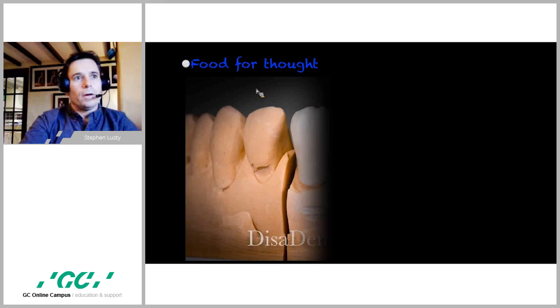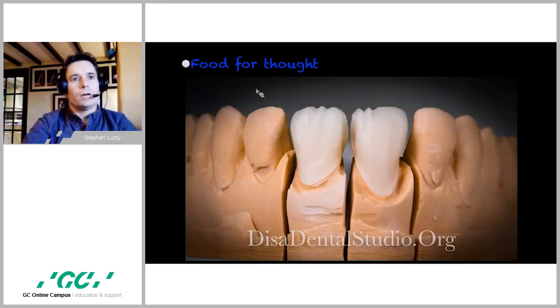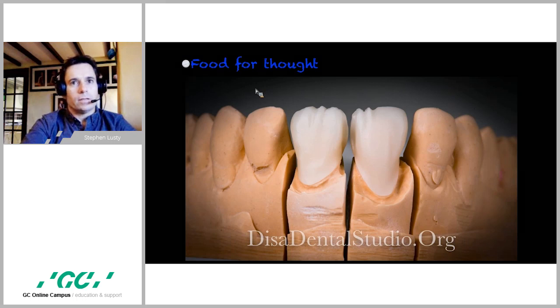So now to wrap up, I thought I would share with you something that has created a little bit of a buzz of late. I was in a meeting recently where we were chatting about the use of LiSi as a press over zirconia material, and I didn't really see the point. That is until I went away and really thought about it. Now, it is not something that I'm currently doing, so Bill Murray kindly allowed me to use these images of a case study posted recently on Facebook.